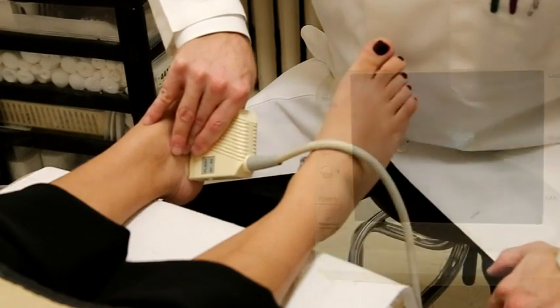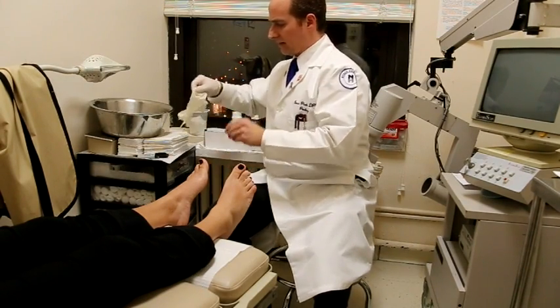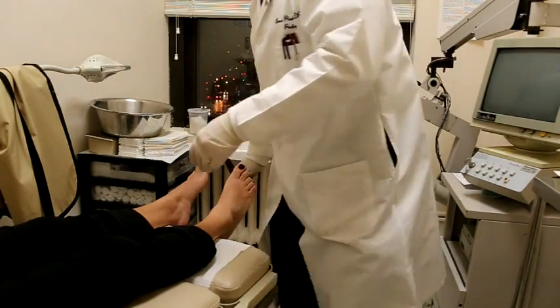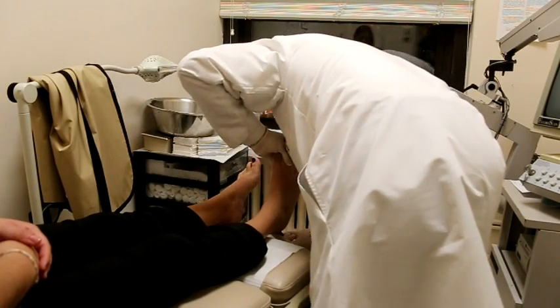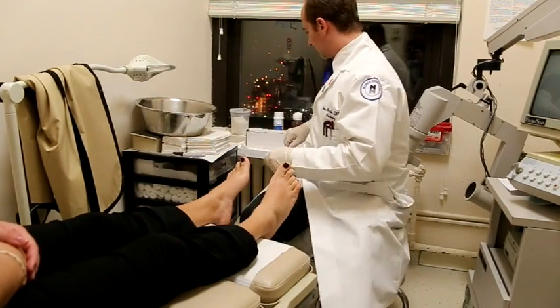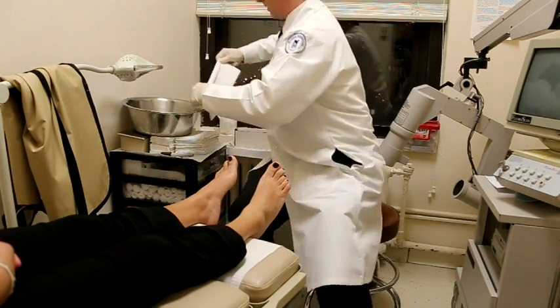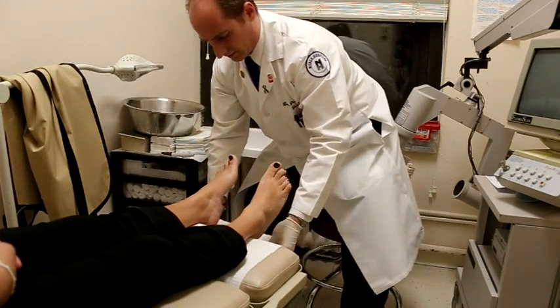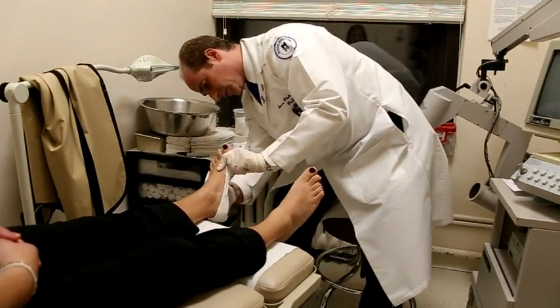So here we're going to cast our subject for the custom-made orthotics, which is done in a very unique way. First, we must check the heels. The heel is very important, as it is the first part of the foot that usually strikes the ground. It must be taken into account. So now we apply casts for the orthotic in a very special way.